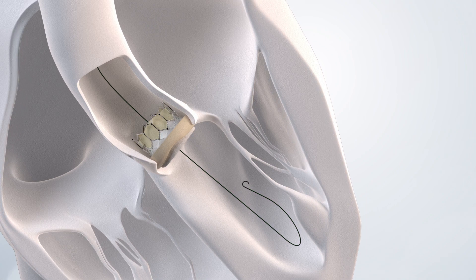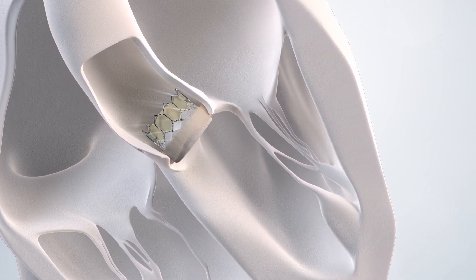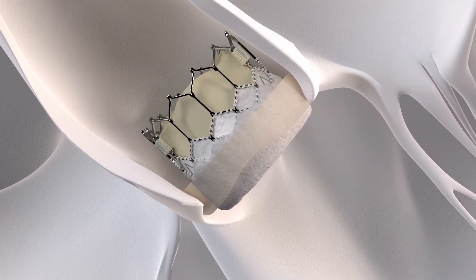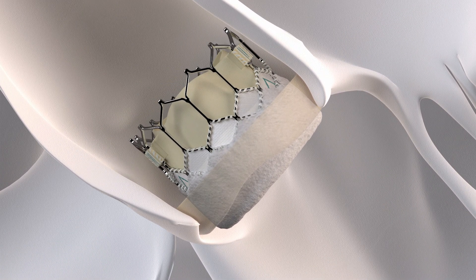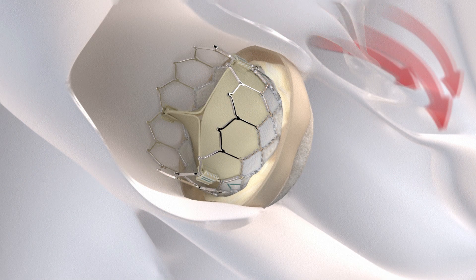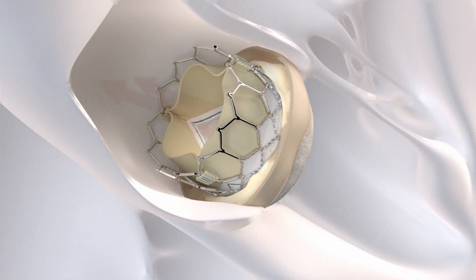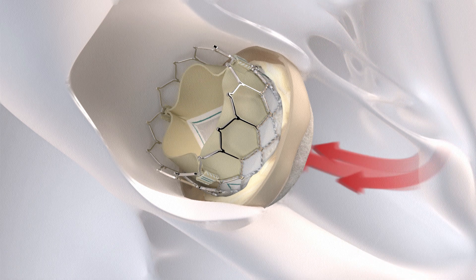The frame of the Edwards Sapien III Ultra Resilia Valve is strong, and will use the calcified leaflets of your diseased valve to secure it in place. Once in place, the Edwards Sapien III Ultra Resilia Valve begins functioning immediately, with the leaflets opening and closing to pump blood to the rest of your body.